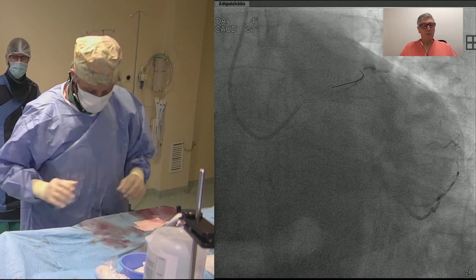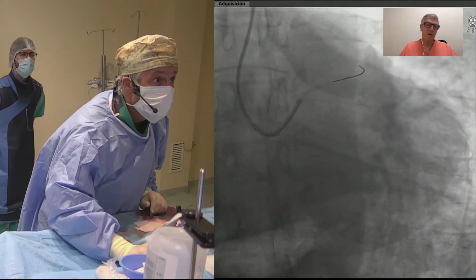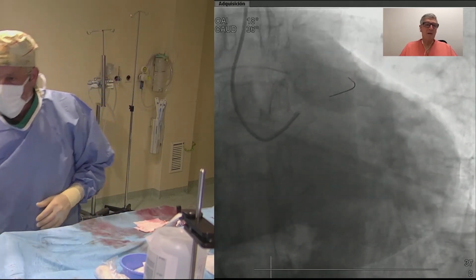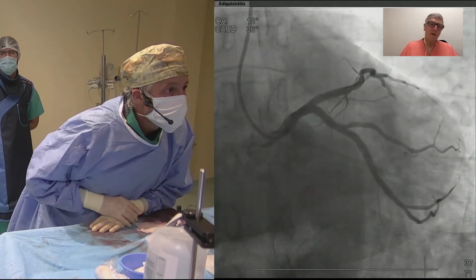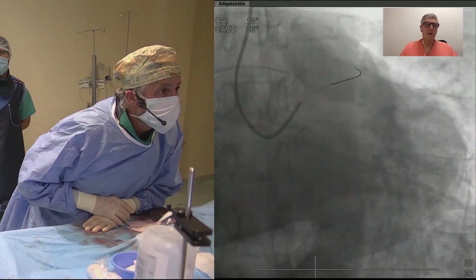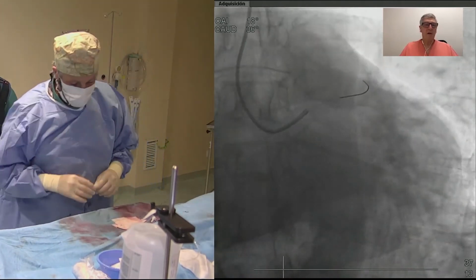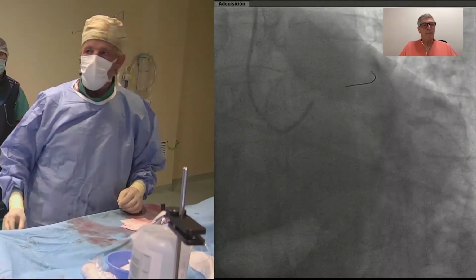Yeah. Absolutely, but in this case, I think the strategy was the best one. Of course, if needed, you can add a stent in a T-shaped configuration or TAP if you are not sure about the ostial positioning of the stent. I think it's really a very good result. So maybe time to conclude the session. Yes, we can conclude the session.